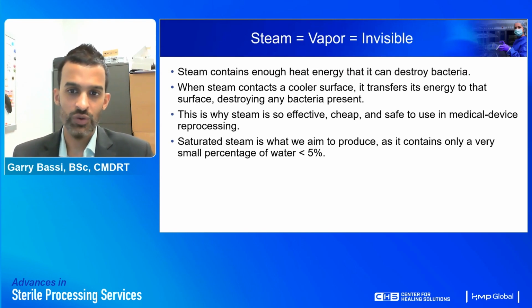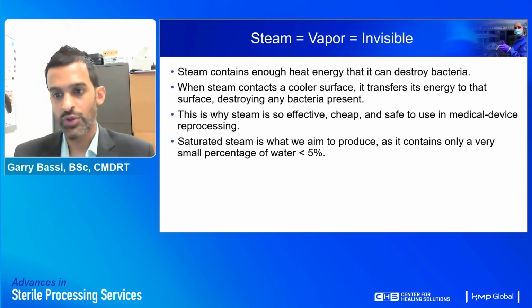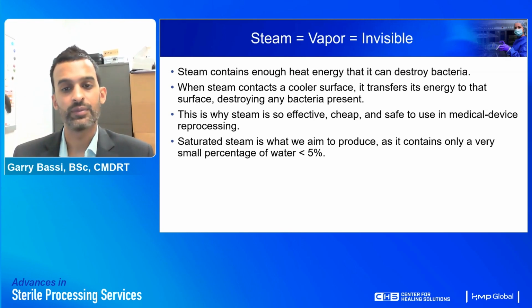This is why steam is so effective, cheap, and safe to use in medical device reprocessing. Easily generated, safe, and effective. Saturated steam is what we aim to produce, as it contains only a very small percentage of water, usually less than 5%.